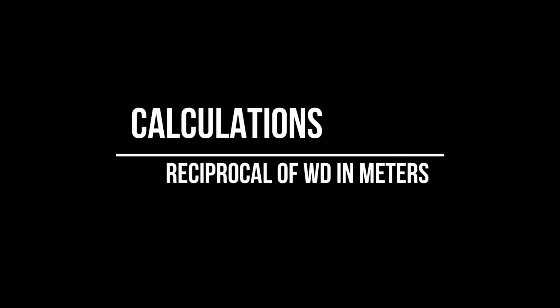So how do we make these calculations? Simply take the reciprocal of the working distance in meters, and the result will be the dioptric power equivalent to the working distance. So this is the distance that you're going to subtract. For example, if working at 0.5 meter, which is 50 centimeters, the reciprocal of this is 1 divided by 0.5, which is equivalent to 2 diopters. You therefore must subtract 2 diopters from the final results that you get.